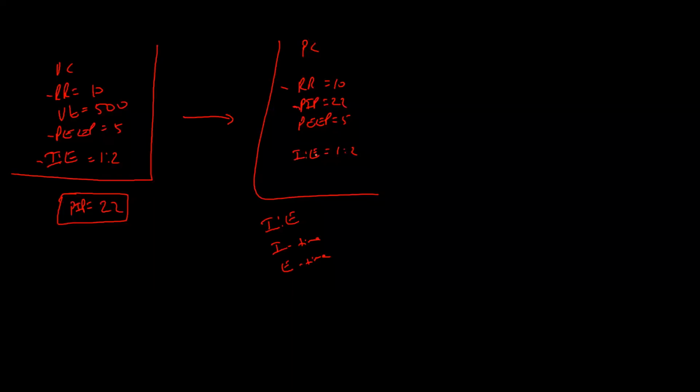And now, is this like if you did a blood gas and say their CO2 was high, and you needed to blow some of that off at this point? Is that when you would redo your peak inspiratory pressure? Yep, you would either adjust the respiratory rate or the peak inspiratory pressure, depending where the patient is.